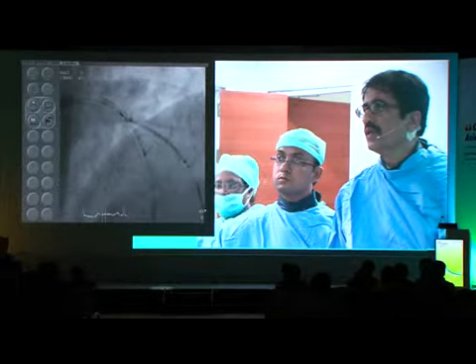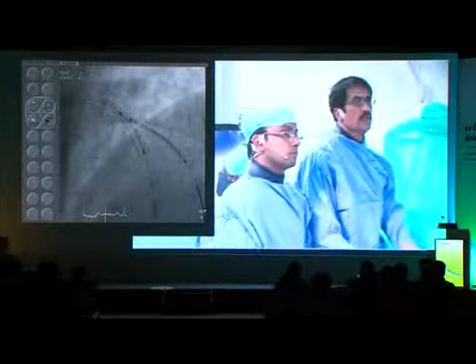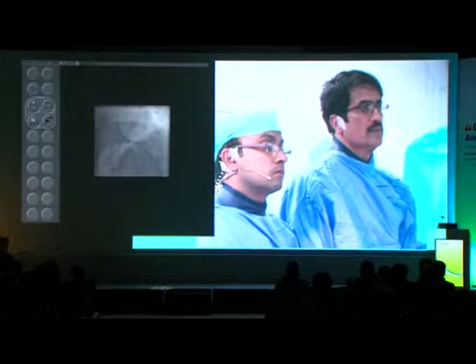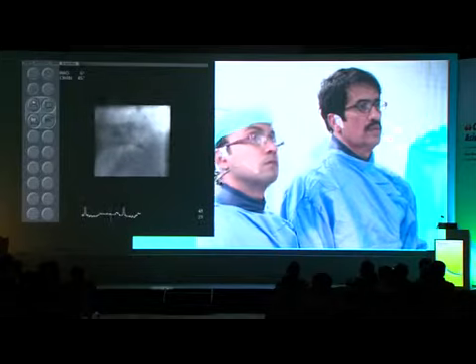Okay, can you give me a stent boost? Okay, I think we're looking quite good.